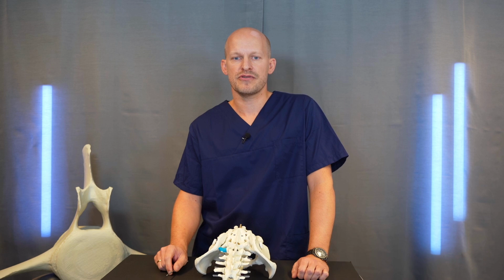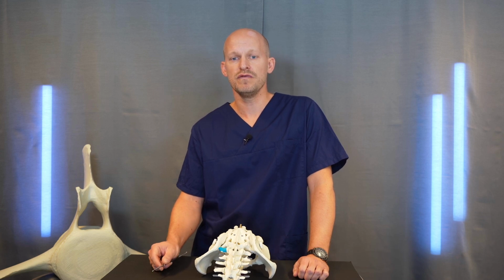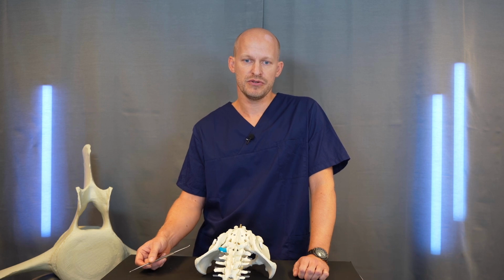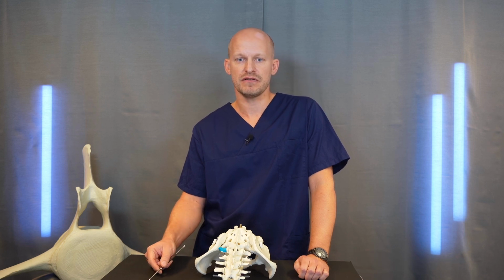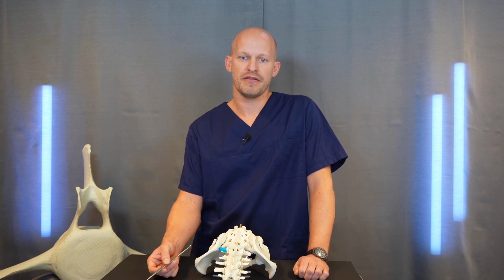A CT reconstruction of the pseudarthrosis is strongly recommended preoperatively in order to determine the exact anatomy of the enlarged transverse process. However, intraoperative orientation during minimally invasive removal of the false joint can be very challenging. I therefore recommend using intraoperative navigation, for example with a navigated diamond burr, to resect the process.